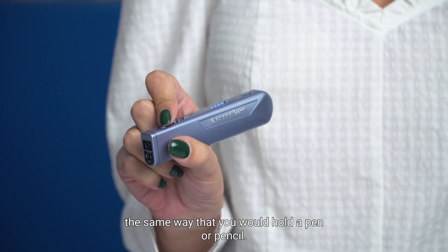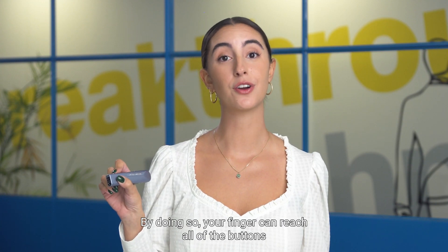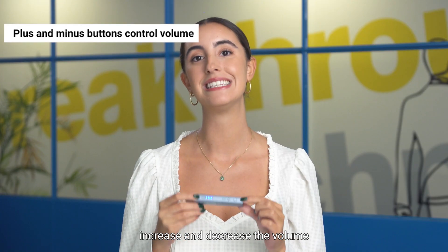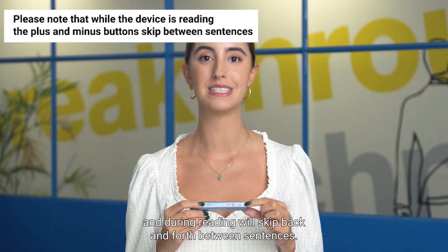Once the device is operational, place it in your hand the same way that you would hold a pen or pencil. By doing so, your finger can reach all of the buttons that you will be using while reading. The plus and minus buttons increase and decrease the volume, and during reading will skip back and forth between sentences.